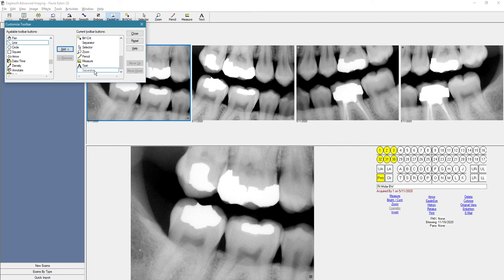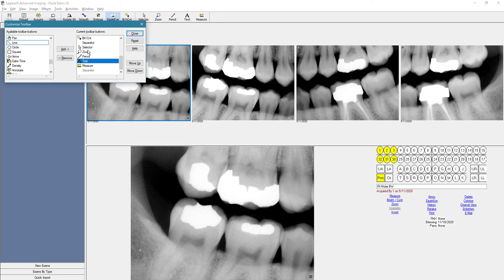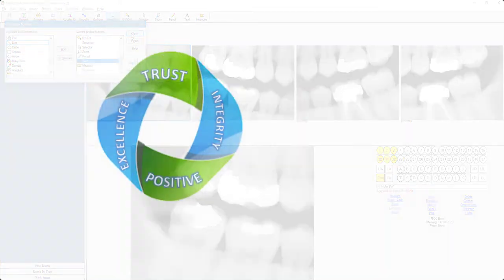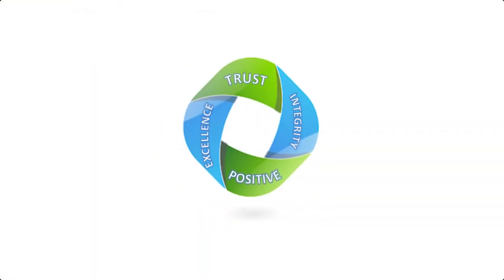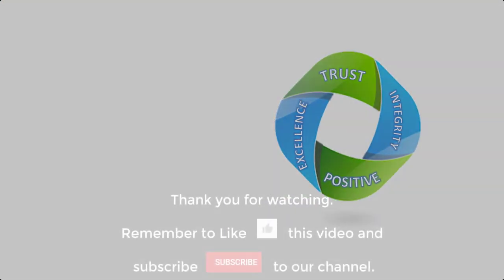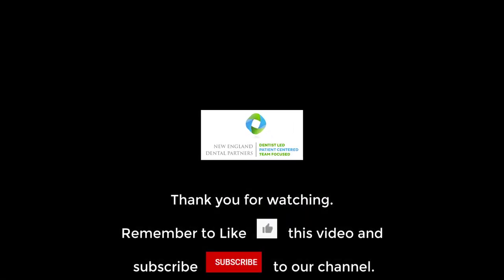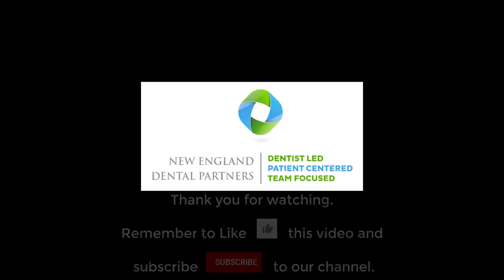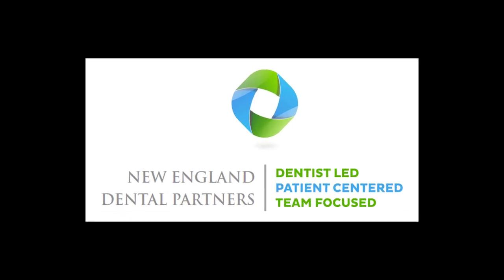You can also move it up, move down. You can move tools around on the toolbar as needed. So let's get started.